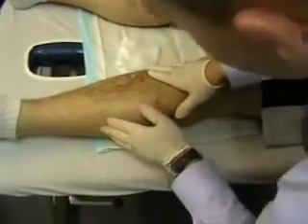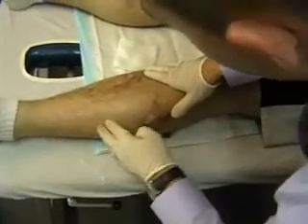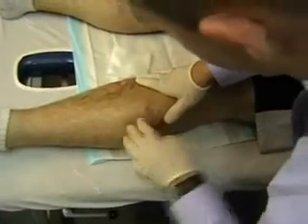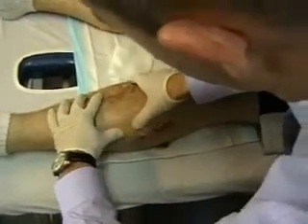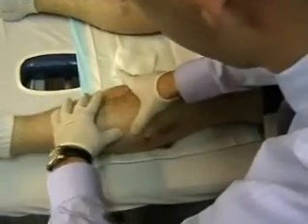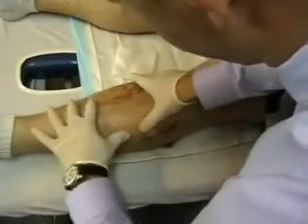This is quite a classic finding of compartment syndrome. You can actually look at this anterior compartment — it is firm and hard, like a block of wood. It looks like the muscles are really swollen up and under a lot of pressure there.